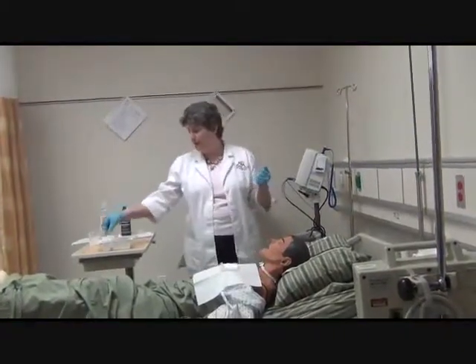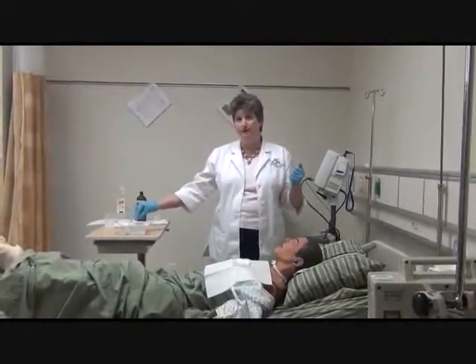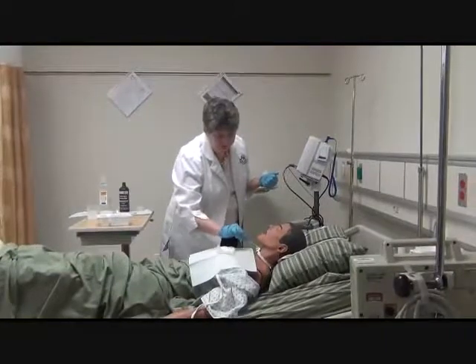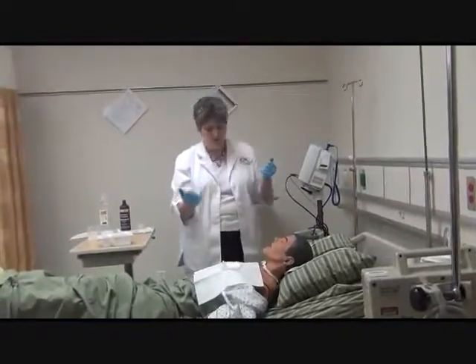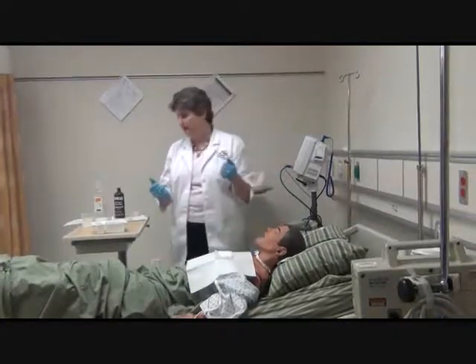If you have a patient with a lot of secretions, understand that you may need to have more supplies, so open those up as part of your sterile field. And I'm going to go around the edges of that face plate again. Q-tips work really nicely at getting up underneath the face plate for your patient.